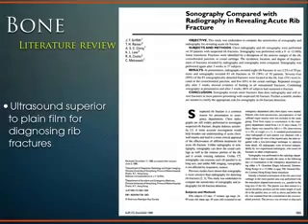But again, when you look at the literature, because it is a new modality for imaging in MSK, a lot of people are trying to study this and make sure that we're not just kind of assuming what we can see, making sure we're comparing to standard of care, whether it's X-ray or MRI or arthroscopy, making sure that what we think we're seeing, we actually are seeing. And most of the studies that are coming out are showing quite a benefit to ultrasound, and that it's either as accurate or in some cases even more accurate than some of our traditional modalities.